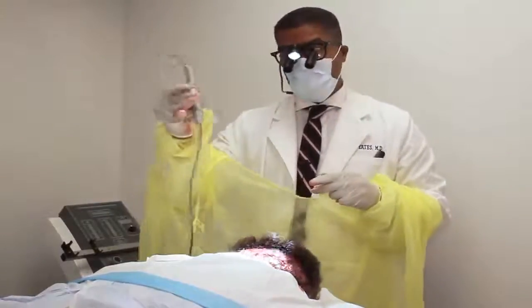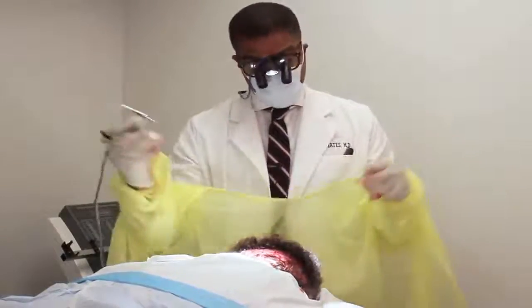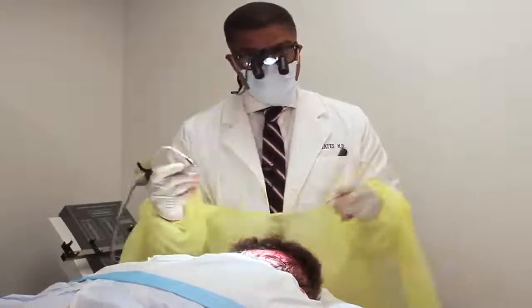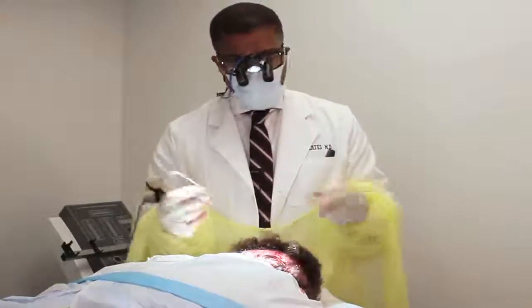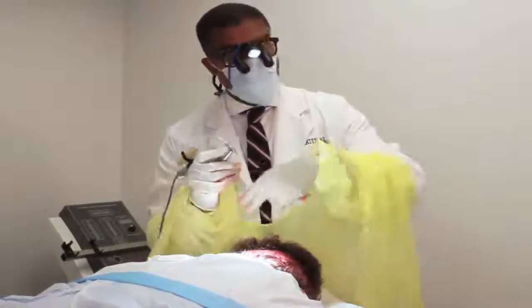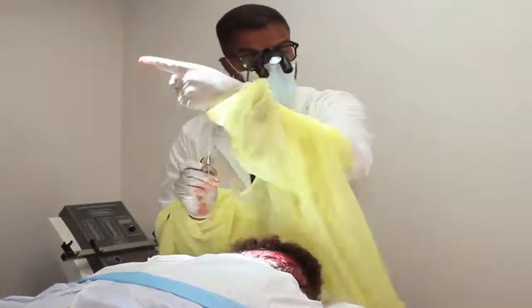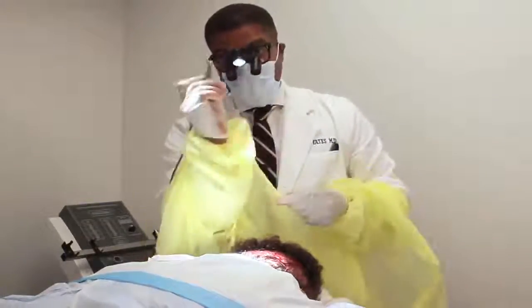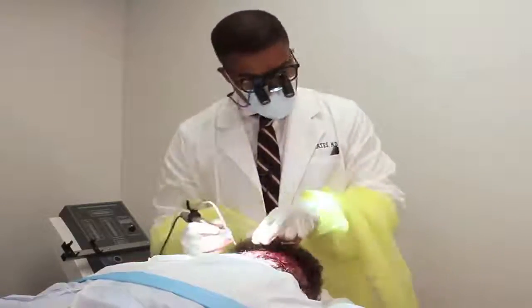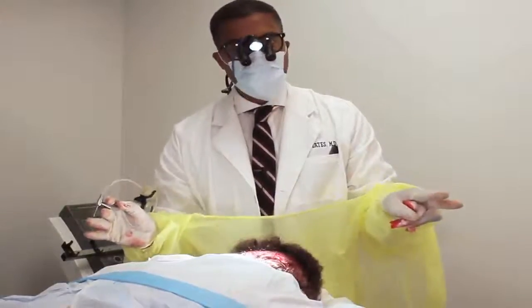The Neograph is an instrument held by a human with various levels of skill that punches grafts. This can be great if you're good at it — like playing golf. Two golfers with the same club: one tees off and hits 300 yards down the fairway; the next guy tees off with the exact same club and shanks it into the woods. The same thing can happen with any of these instruments. Two different doctors use this — one could be boom, boom, boom, beautiful results, and the other could make mincemeat out of the back.